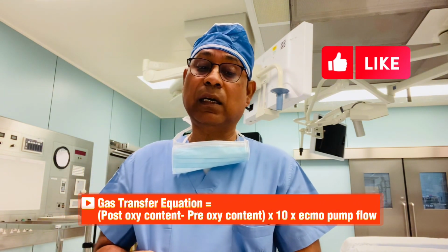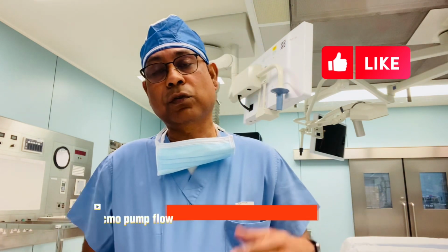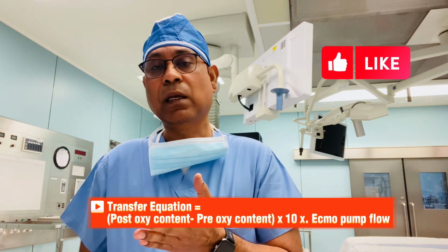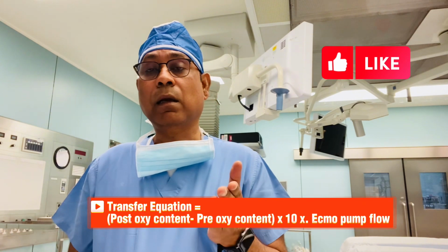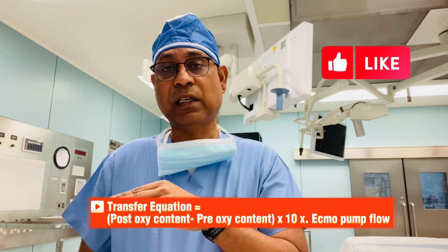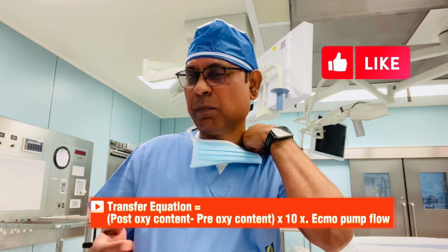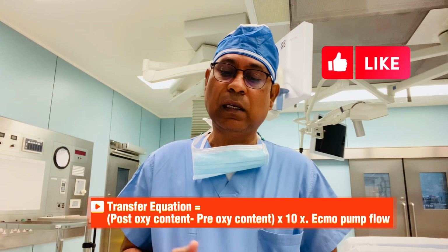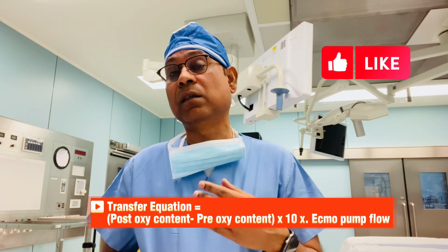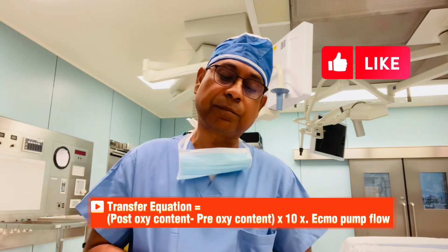The 10 is a constant, and you multiply by the present pump flow. The flow running on the ECMO, for example in a VV ECMO, can sometimes be 3 liters or 4 liters, and we want to see whether the efficiency of the membrane is going down or not.